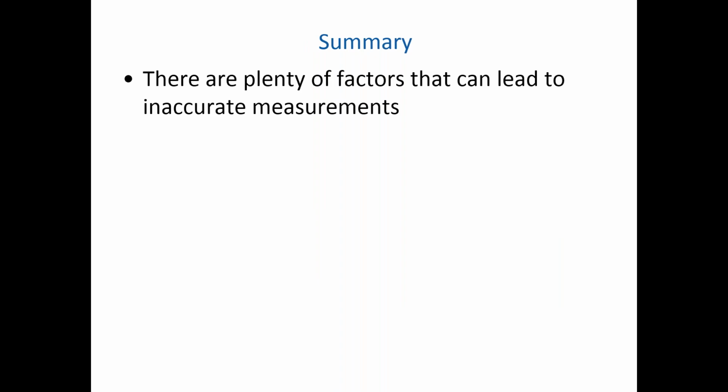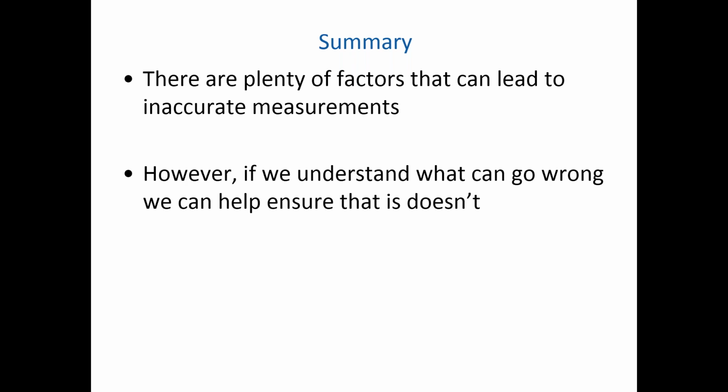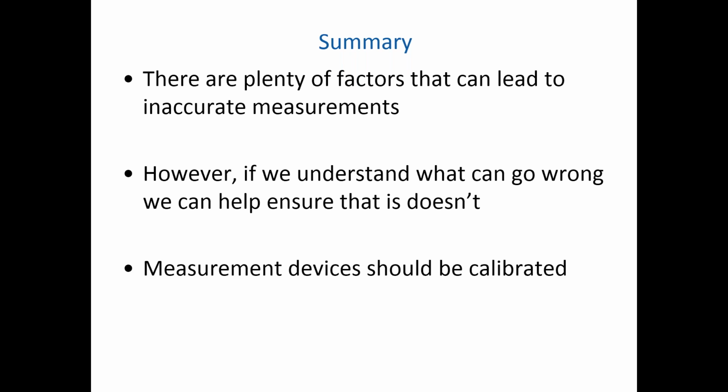So to summarize the content of this webinar, I think it's important to realize that there are plenty of factors that can lead to inaccurate measurement. However, if we understand what can go wrong, we can help to ensure that it doesn't. And it's really important to make sure that our measurement devices are calibrated. I've provided you with examples of calibration curves for both the needle and membrane hydrophones, but similarly your radiation force balances need to be calibrated as well.